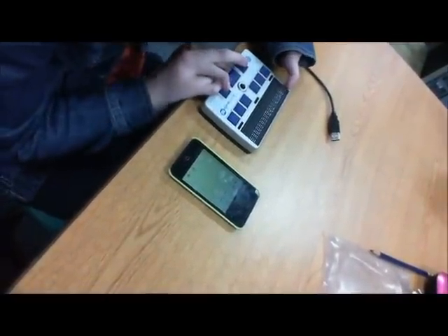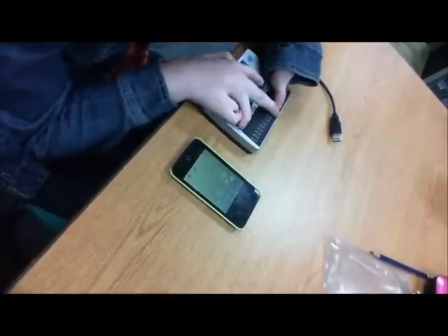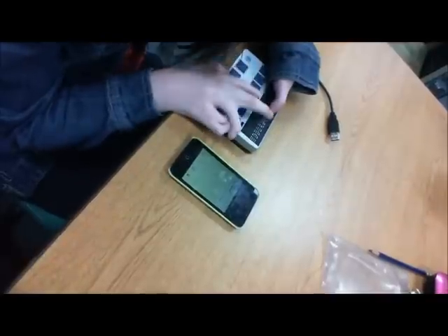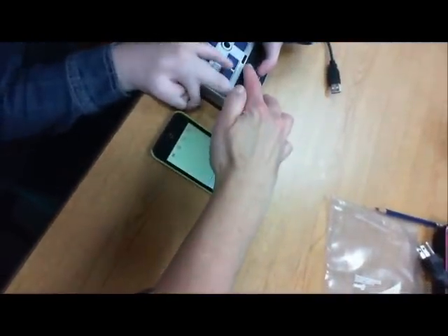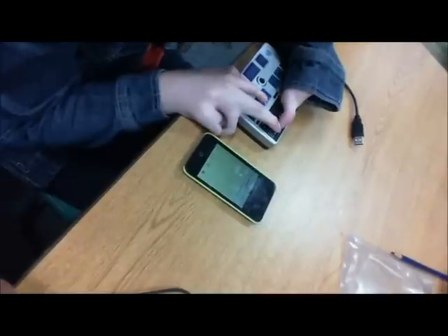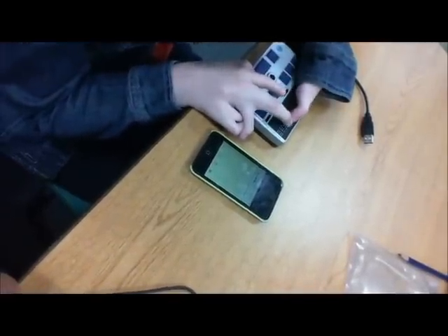I'm not sure you pressed those keys hard enough. Go ahead and read your Braille display to see what you have up there. I see C-O-N. Aha! We had a little delay there, didn't we? That's wrong. So I want you to route your cursor — go to your cursor keys down below the Braille display. Find what letter you want to get rid of and what letter you want to add. Go ahead and correct that and hit your backspace. There you go. Do you like it now?